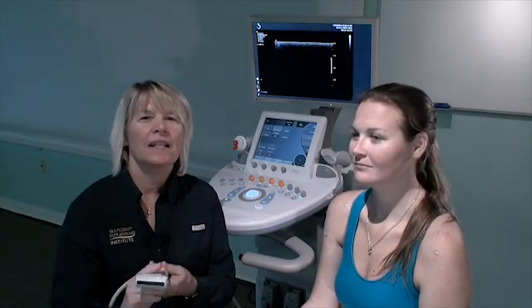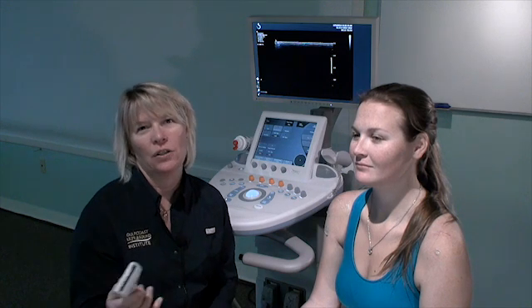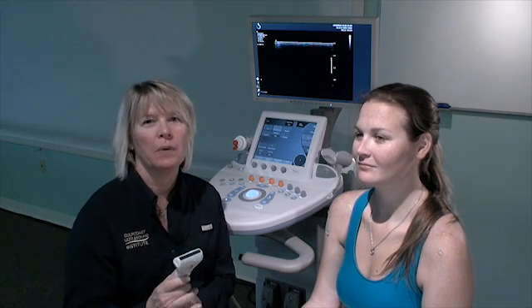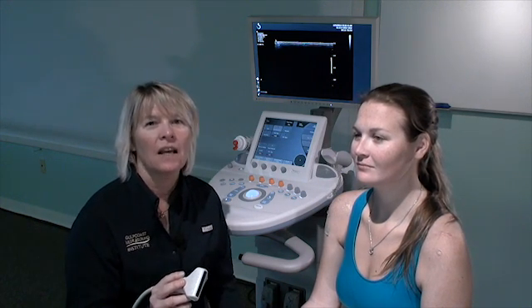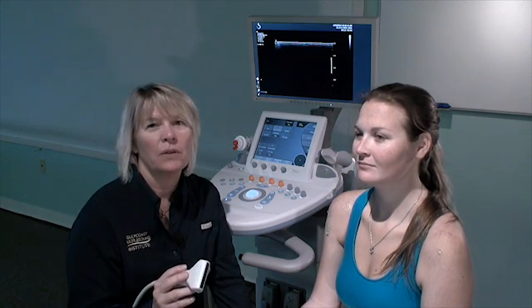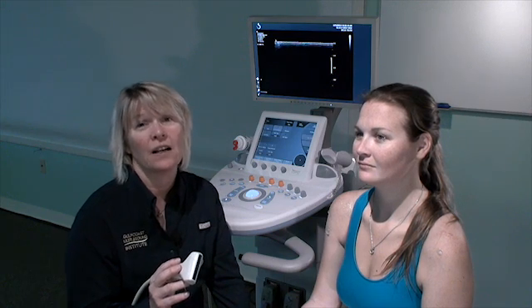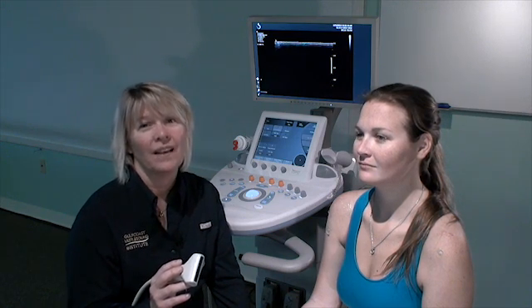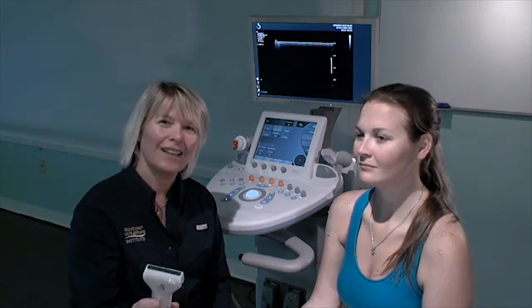By practicing these small transducer manipulations, one will be able to fine-tune your scanning techniques and be able to correct for the artifact anisotropy. That's your scanning tip for today. Now you give it a try.